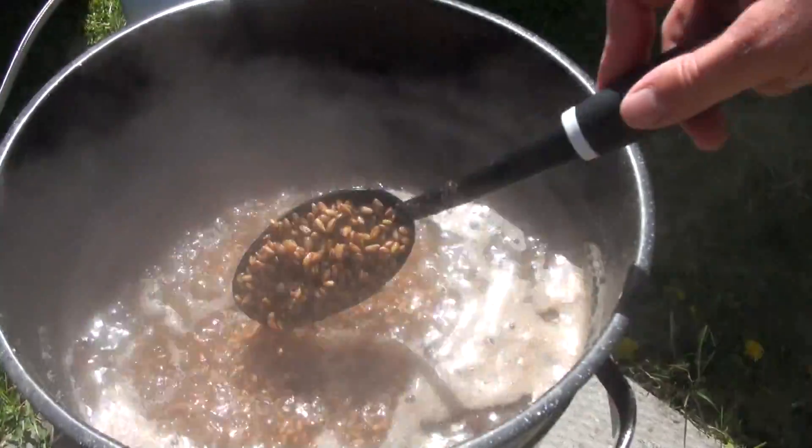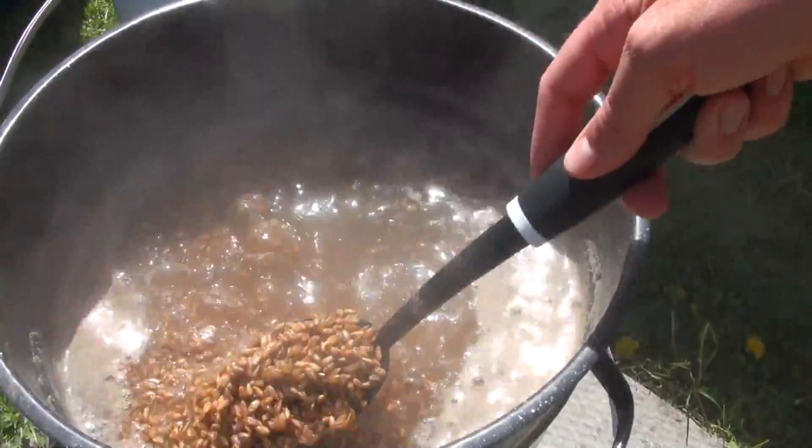After soaking, you want to simmer the grain for about 15 to 20 minutes. All this does is further allow the grains to absorb water. After simmering, you've got to completely drain the water off the grain. You want all the water to be contained within the actual grain kernel and no excess water to be present on the outside of the grain.